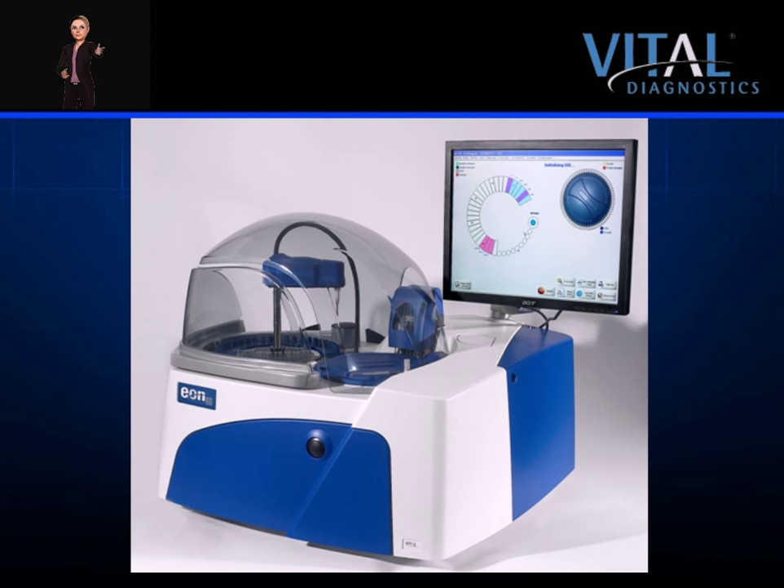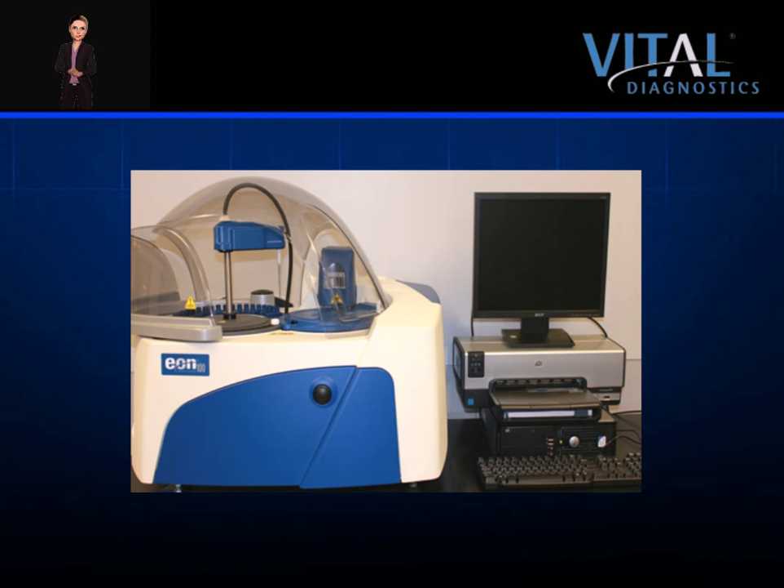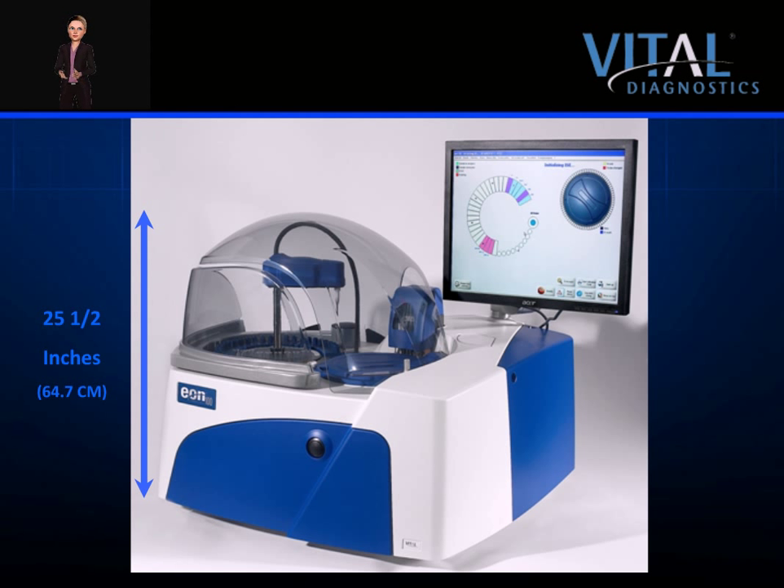The EON100, a bench top chemistry analyzer, features a compact footprint that easily fits on any standard countertop. The analyzer measures 31 inches in height with the monitor on board. The monitor is removable and can be placed on a bench, reducing the instrument to 25 and a half inches. A few inches of clearance above the analyzer is recommended for easy serviceability. The EON is 30 inches across and 29 inches deep. The feet are located at less than 24 inches from the rear, allowing an easy fit on a standard countertop.